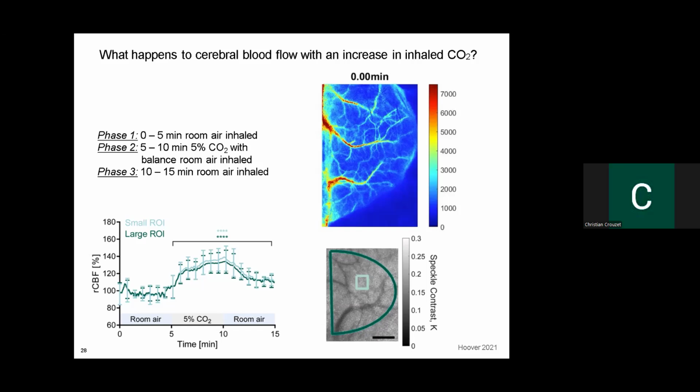So the question is, does the laser need to be coherent? As narrow of a line width as possible for the laser is ideal. There are practical limitations to that, because the more coherent your laser, the more expensive it can get.